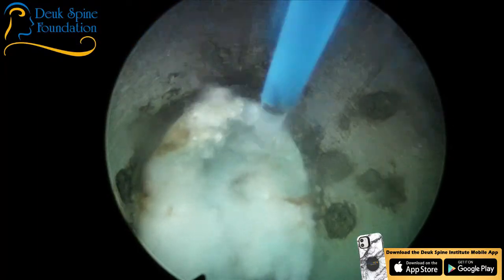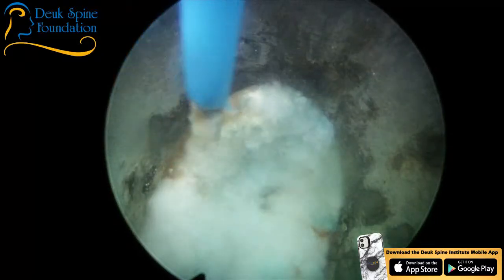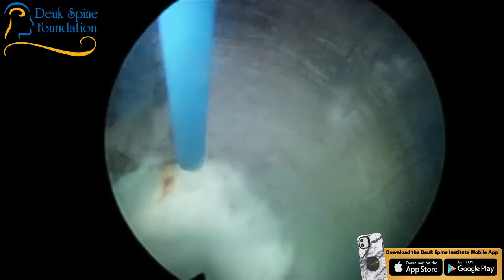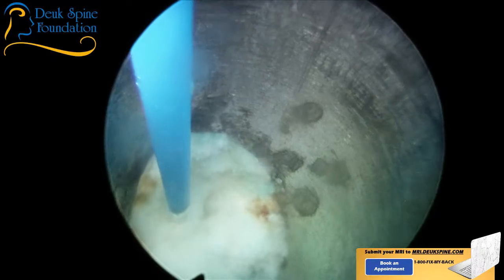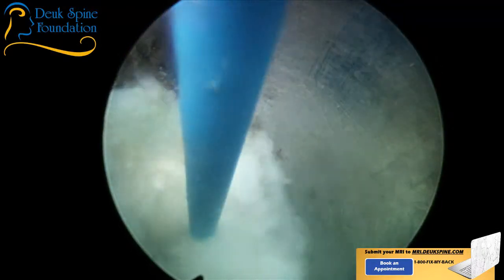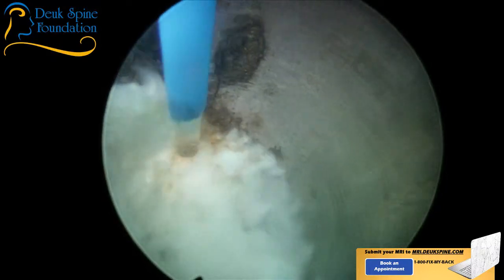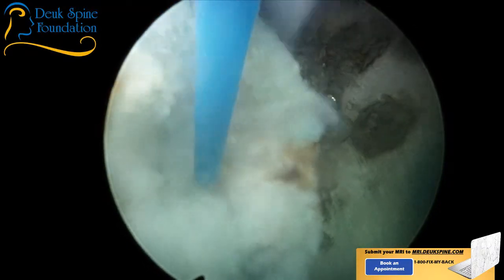All right, so what you're seeing is the silver, the inside of our tube. This is called the tubular retractor. In surgery, we use different kinds of retractors. One type is a blade, which we used in the last surgery. In ACDF, we used blades, and this is a tube. There are different kinds of retractors used in spine surgery. This is a tubular retractor, so it's in the shape of a tube. Some of the more advanced, newer retractors in spine surgery are tubular, and they allow better tissue retraction.